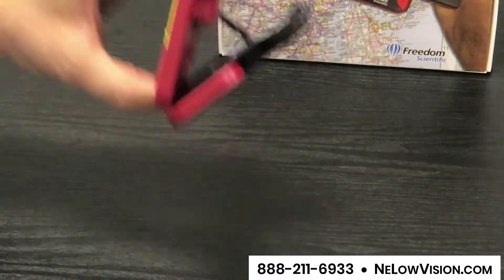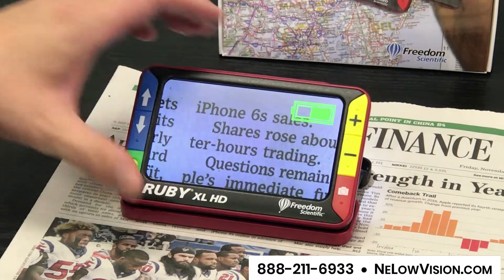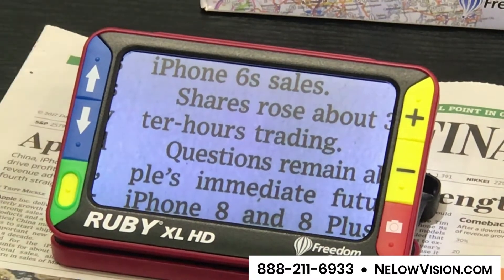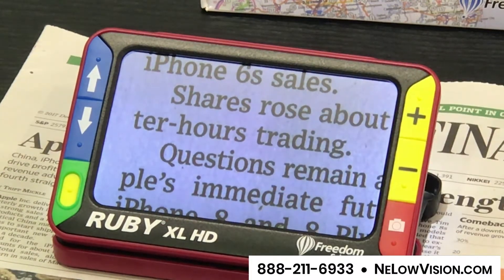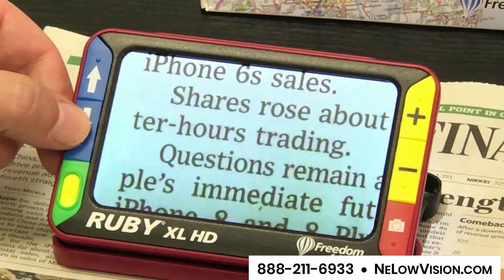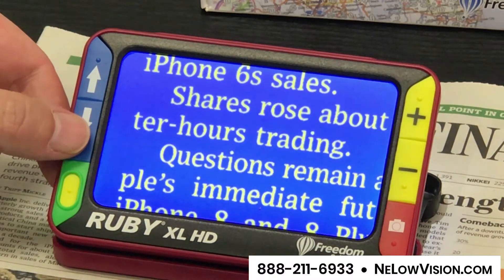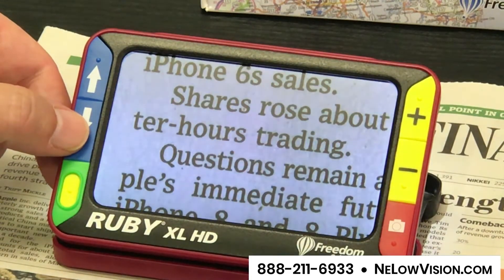You can turn the device on just by opening that stand and placing your material — such as this newspaper — right underneath the device. It shows the battery life for a short time and then displays the material on screen. I can increase or decrease the magnification, and I can change multiple contrast modes by pressing these buttons and toggling between them. This is enhanced positive mode, enhanced negative mode, and then multiple different choices for contrast modes with different colors and backgrounds, whatever is best for your vision.